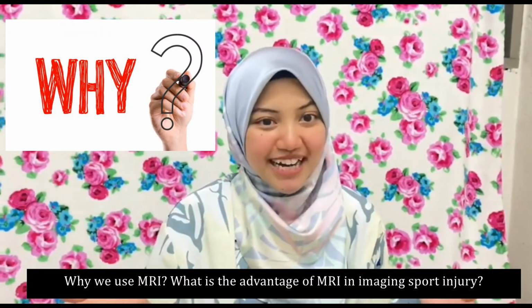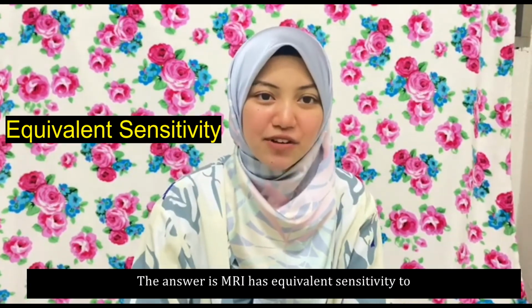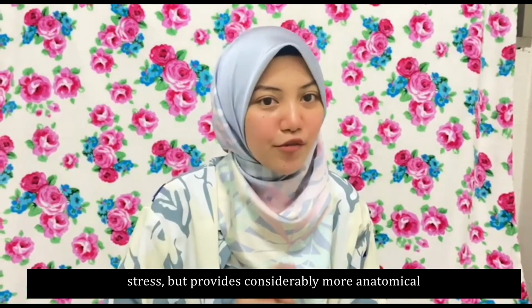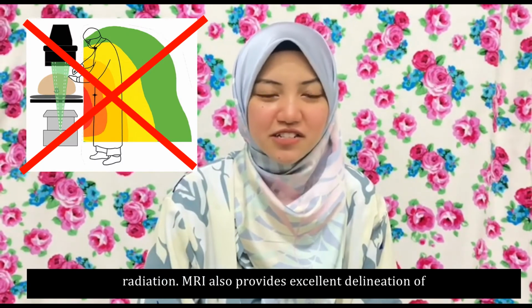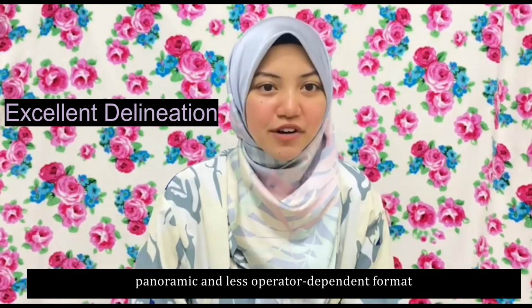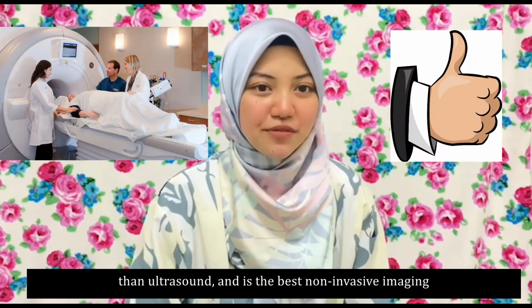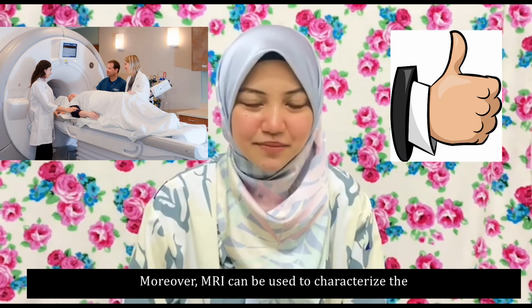Why do we use MRI? What is the advantage of MRI in imaging sport injury? The answer is MRI has equivalent sensitivity to isotope bone scanning for the detection of bone stress, but provides considerably more anatomical information without exposing patients to ionizing radiation. MRI also provides excellent delineation of both deep and superficial soft tissue in a more panoramic and less operator-dependent format than ultrasound, and is the best non-invasive imaging test for injuries of articular cartilage and fibrocartilage.